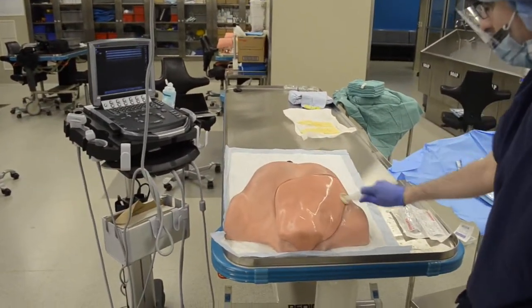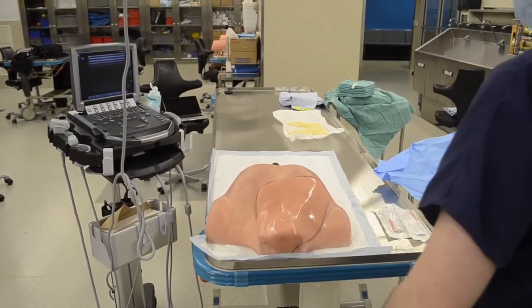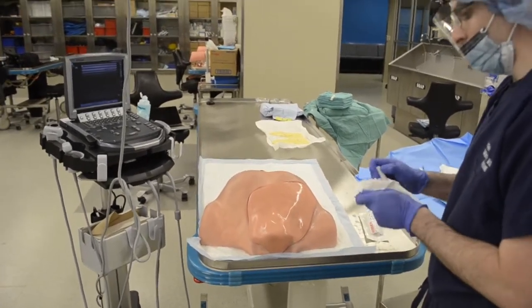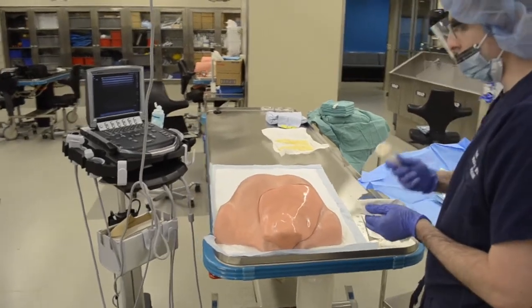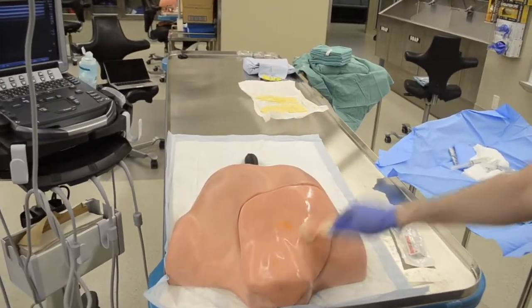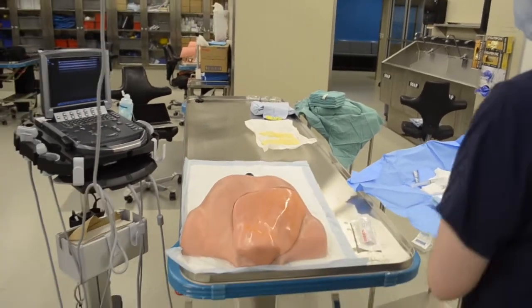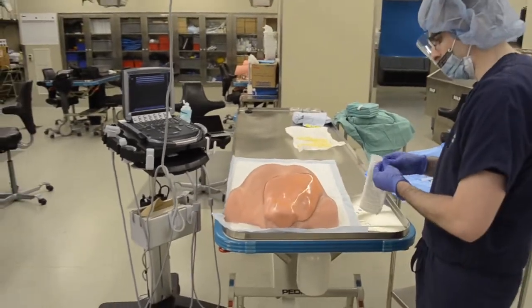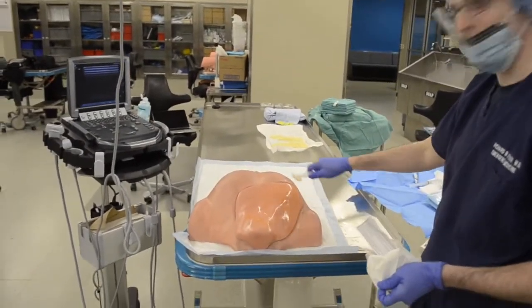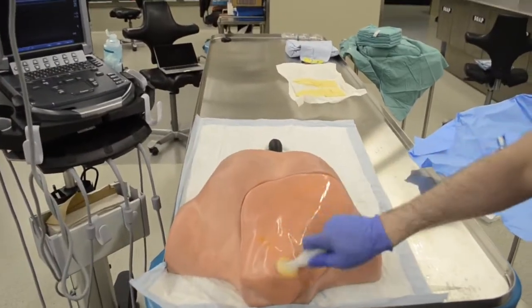And I'll scrub all the way down past the nipple, all the way past the neck on both sides. And I like to use 3 of them. The other advantage of that is if you have to switch to a subclavian, it's actually completely already sterile right here as long as you go down all the way. And then we don't have to re-gown, re-drape.